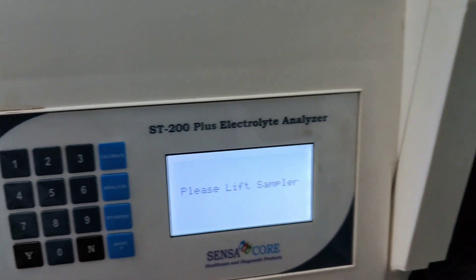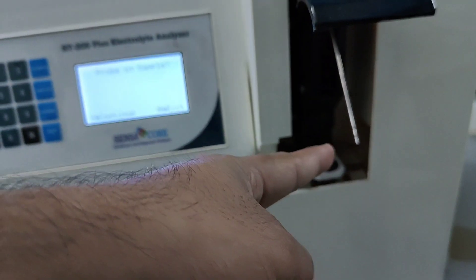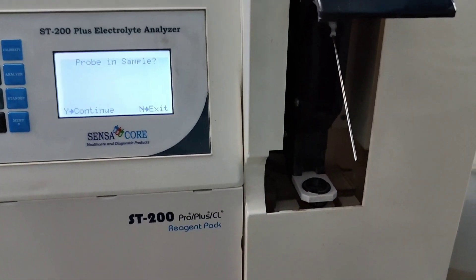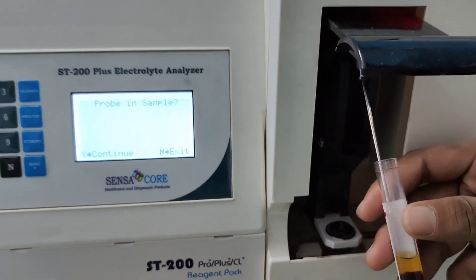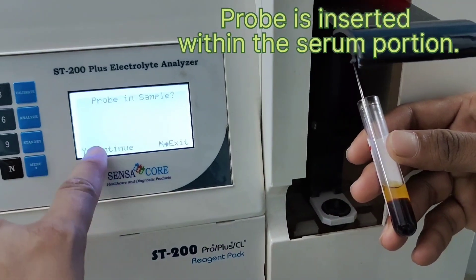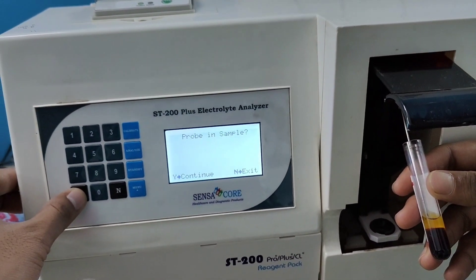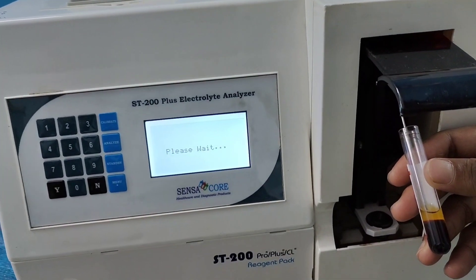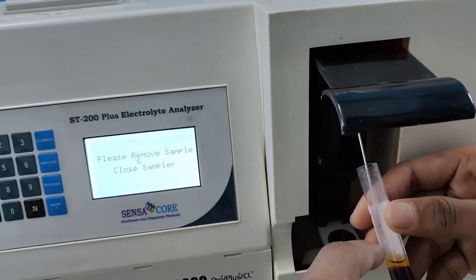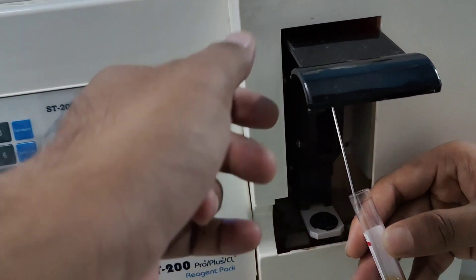Please lift the sampler — this is the sampler. I am going to lift the sampler. This is the sample probe. Now I am going to aspirate the sample. Insert the probe within the serum portion and press Y for continue. Make sure that the probe is inserted into the serum portion.